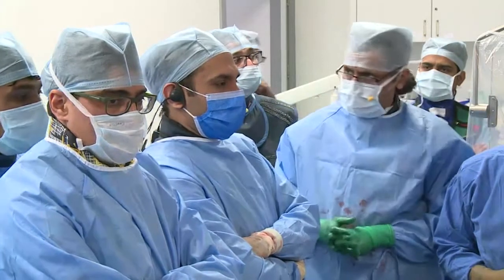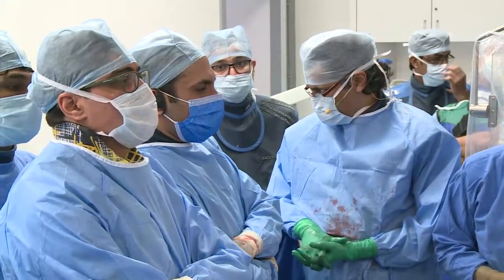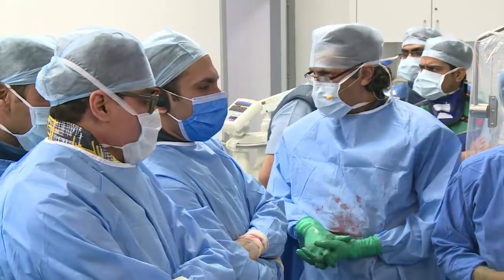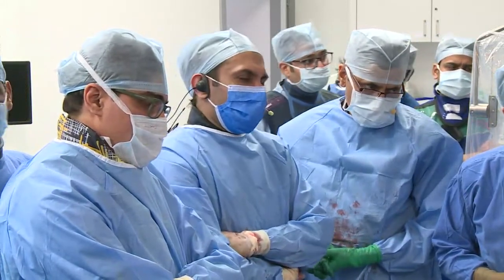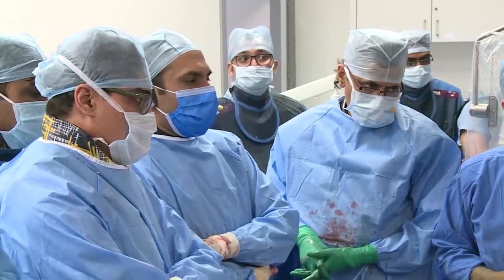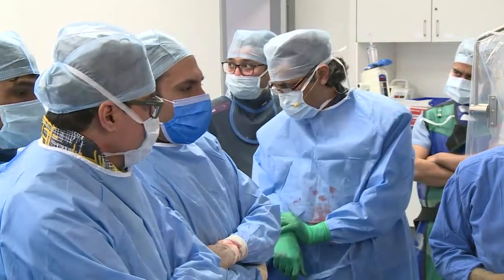If the capturing is not 100%, is that your question? The question is whether the position of the balloon tip pacemaker, the way you do it with a deflated balloon, is in your opinion stable enough for balloon expandable valve implantation? Yes. Okay, I'm happy to hear that. I think that's a very important question: how do you make sure that your capturing will be throughout when you are doing a TAVR with a balloon expandable valve, and there is no failure to capture.